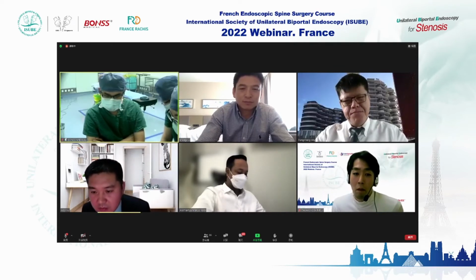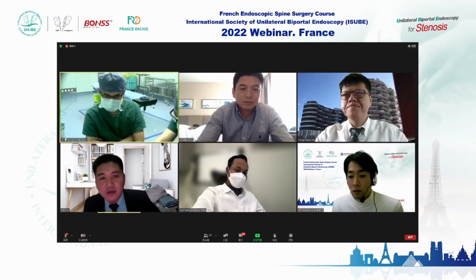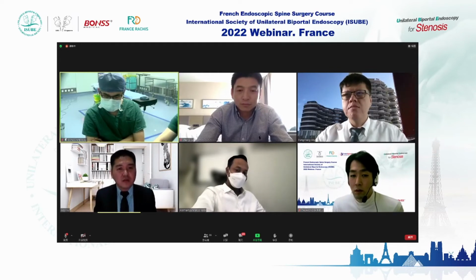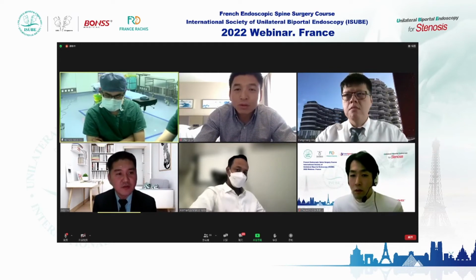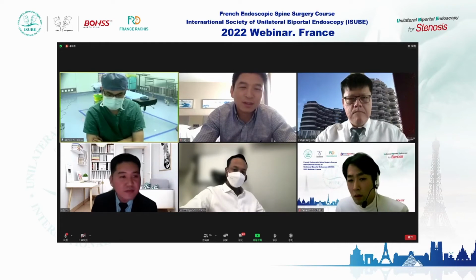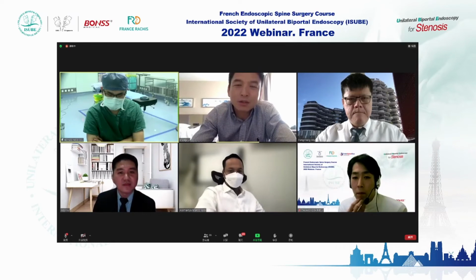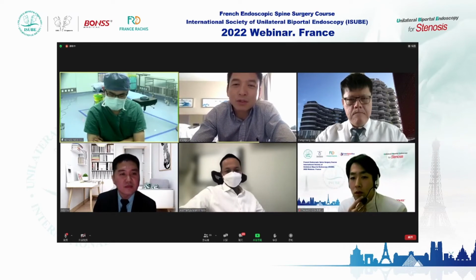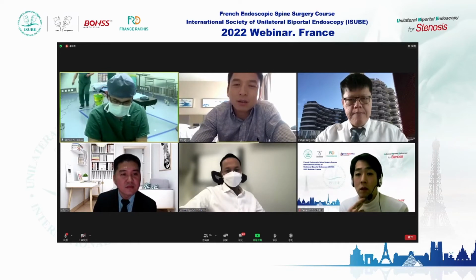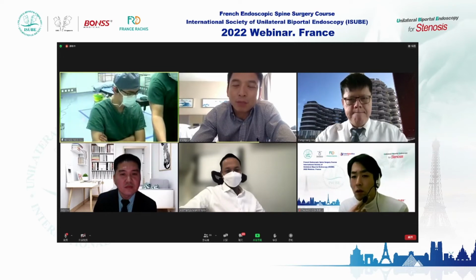Dr. Abraham, maybe, how do you teach trainees in the UBE skills? Dr. Liu, what's your plan for the beginners? What's your advice to learn the UBE? I give lectures and show live surgery like Professor Zhang Wei, and we will perform mimic surgeries in animals.